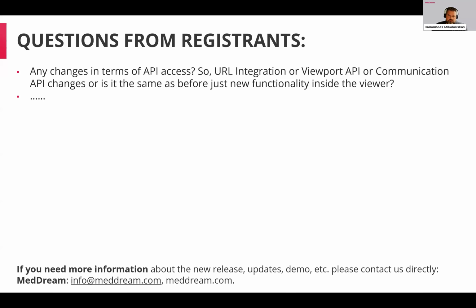So no changes to recent integrations or Viewport or communication API. We are just expanding the functionality, the capabilities of these different integrations.